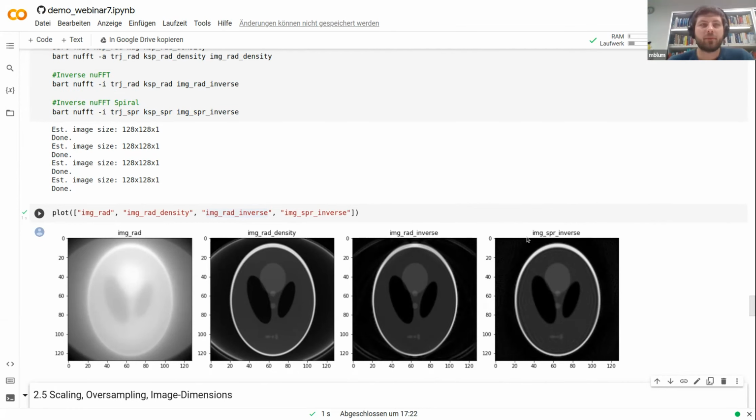Yeah, we have that. I think Christian will show that for the full pics command. Do you? The density compensation? I will show how to use density compensation as weighting in parallel imaging reconstruction, yes, exactly, to speed up reconstruction, especially in the 3D case. But if I understood you correctly, you are doing iterations for the density to get the density compensation correct. Did I understand that correctly?